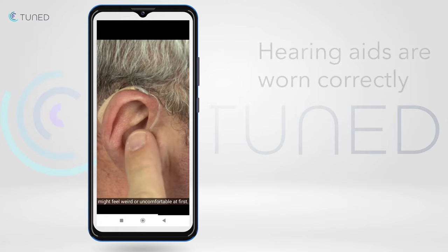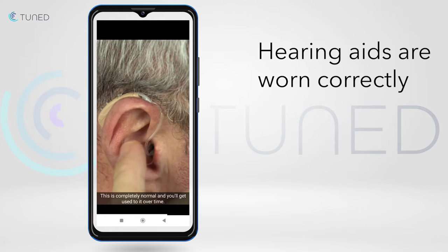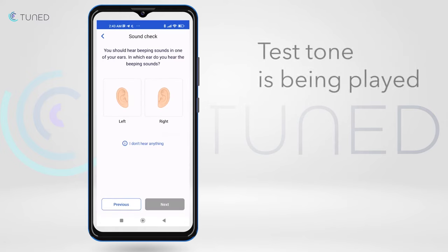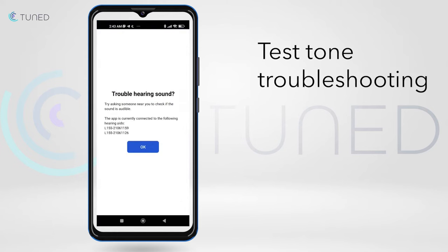After the user has worn the hearing aids correctly, the app will play a test tone to make sure the user has put each hearing aid in the right ear. If the user is unable to hear the test tone, which is normal with some hearing impairments, the app will suggest using the assistance of someone else.